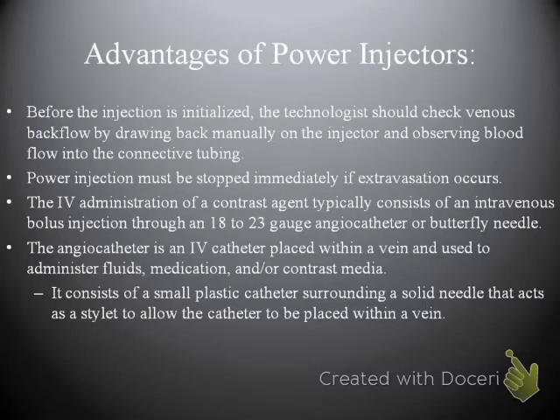It depends on things that are sometimes beyond our control: how much fluid has been pushed through the IV, or how long the IV has not been used. Things like that can also affect whether we can actually draw back fluid from it. So if you don't see blood coming back when you draw back, don't be alarmed.